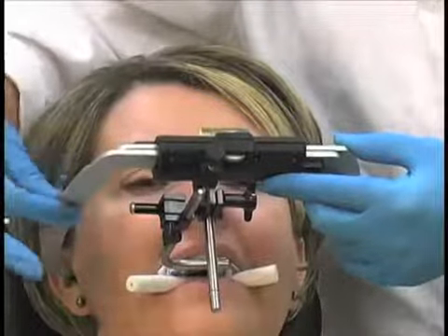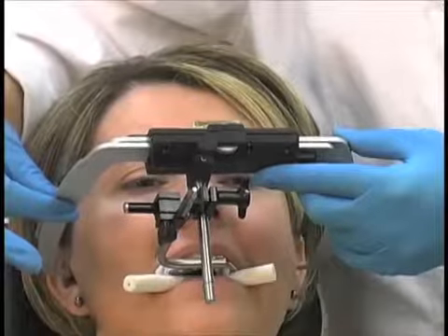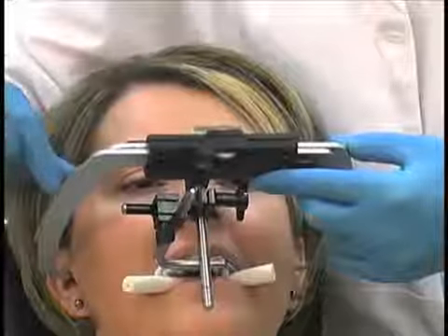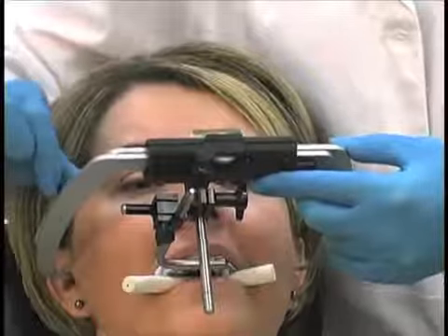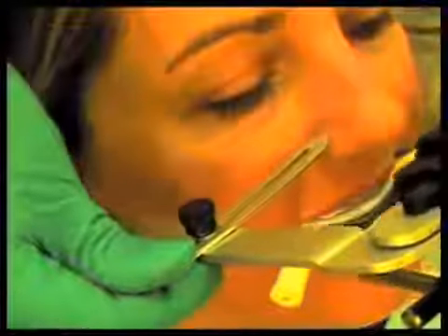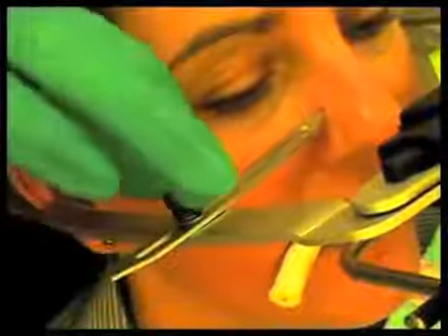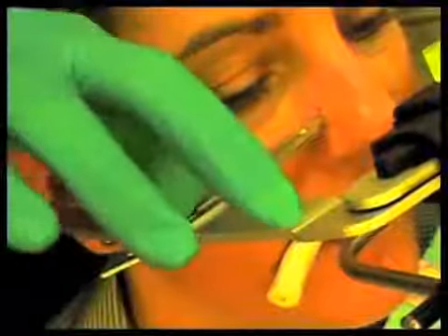Now one of the most important aspects of this procedure is now aligning the infraorbital pointer to the previously placed red dot on the lateral aspect of her nose. This is what's so critical about this Facebow, because this will center your cast on the articulator every single time. It's really so simple, but unique to the system and just makes it great. So we're going to go ahead and get that attached.